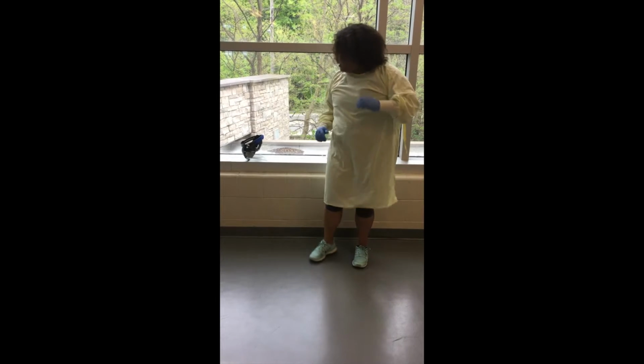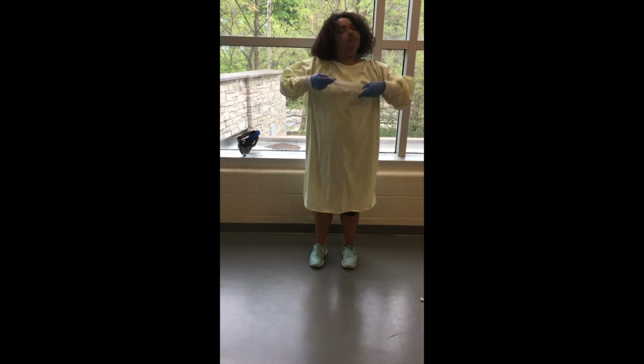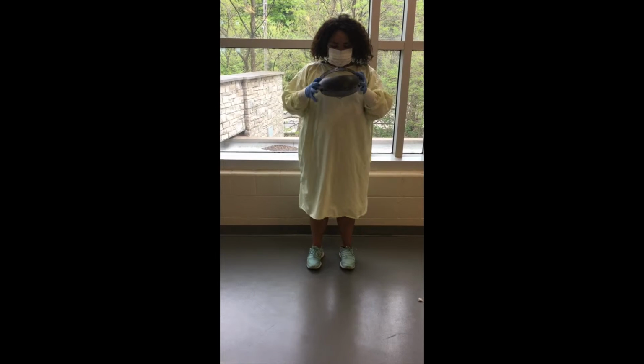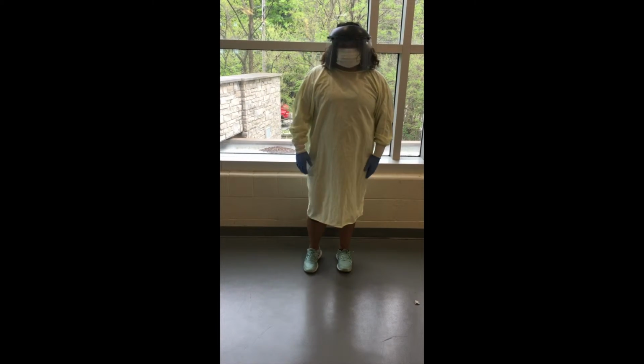And then you're going to want to put on your face mask to protect yourself. And then your full face mask. And that's how you prepare yourself.